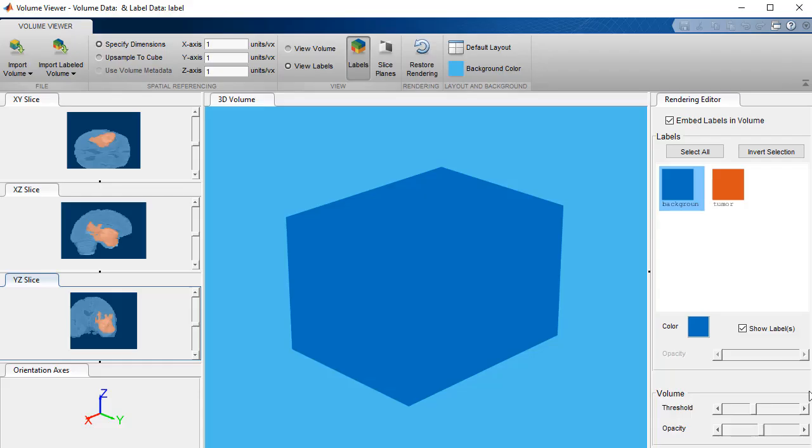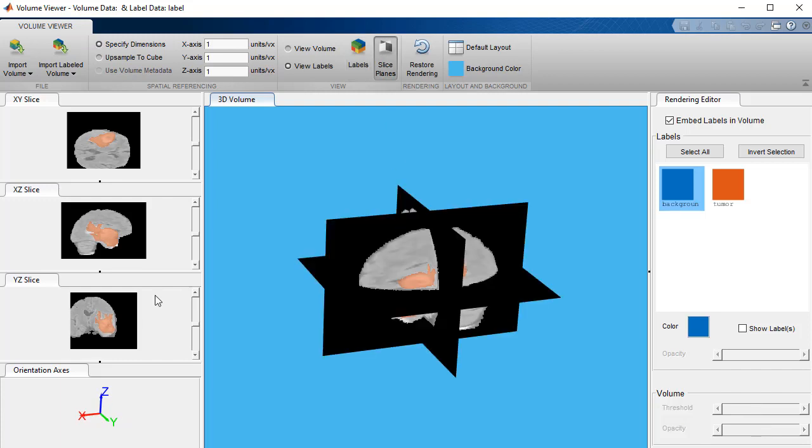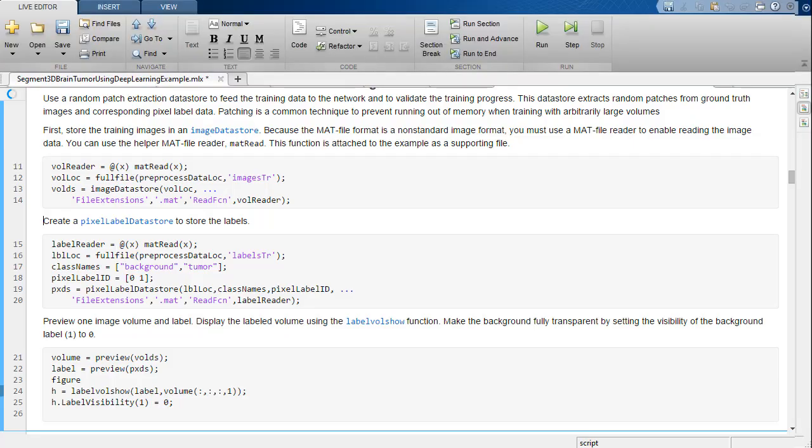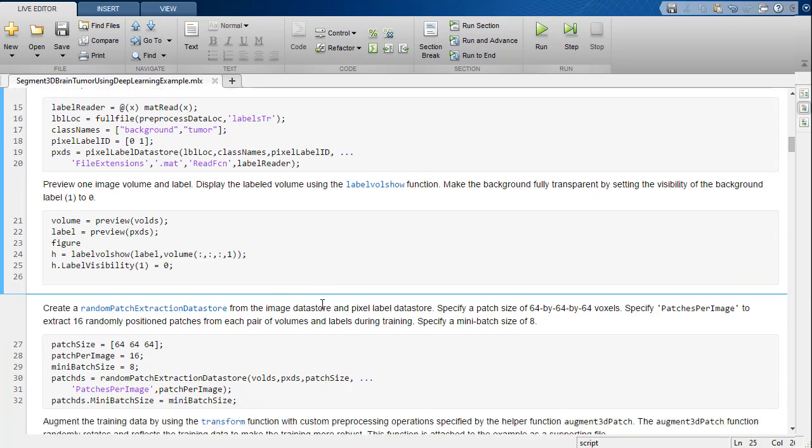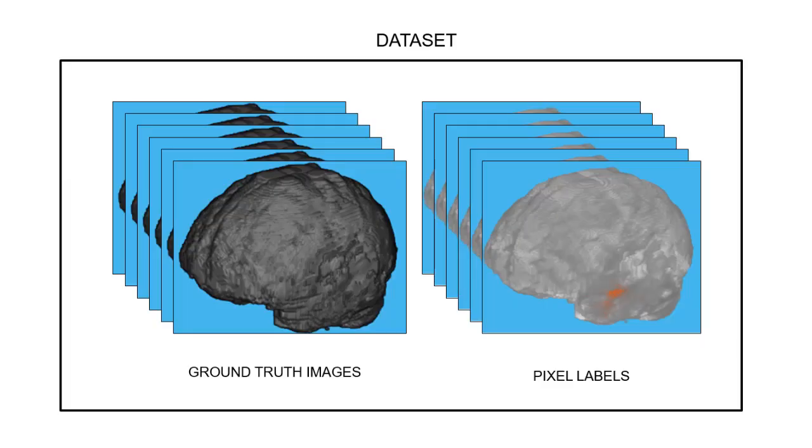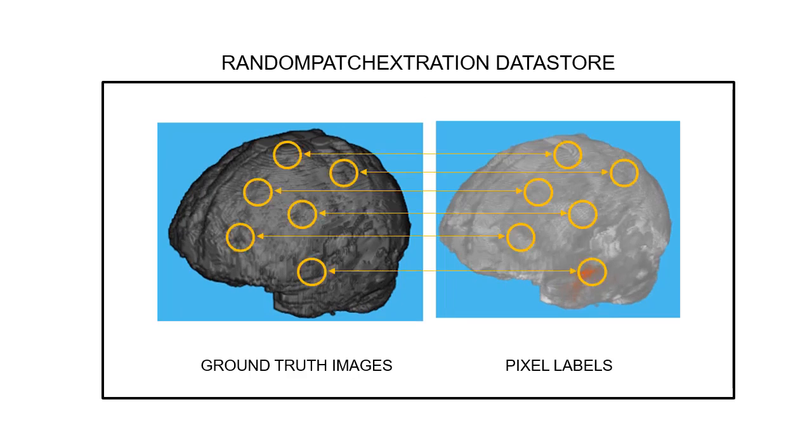The Volume Viewer app lets us explore the labeled volume across the different dimensions. 3D data sets are typically very large, so random patch extraction is used to avoid running out of memory. We will extract random patches from the ground truth images and the corresponding label data for training and validation.